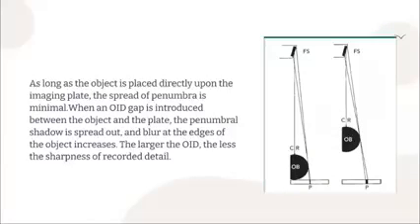As long as the object is placed directly upon the imaging plate, the spread of penumbra is minimal. That means your object or patient is attached to the IR, okay? Spread of penumbra is minimal.